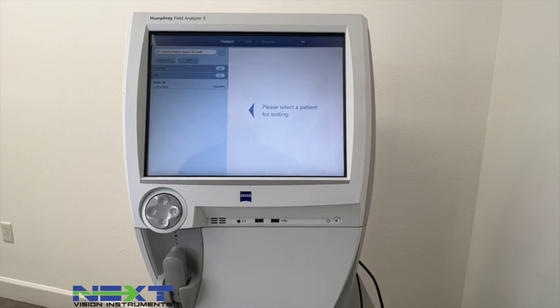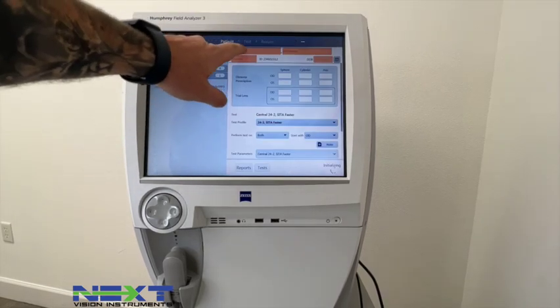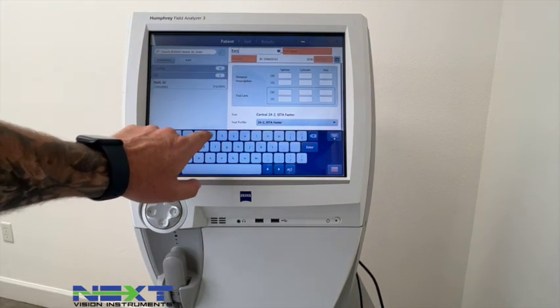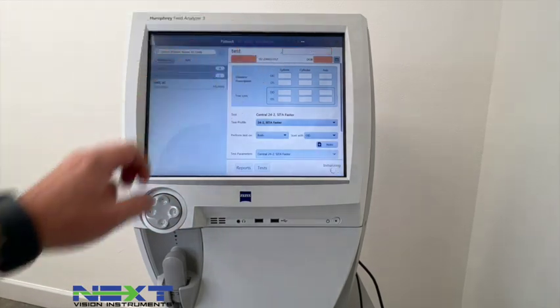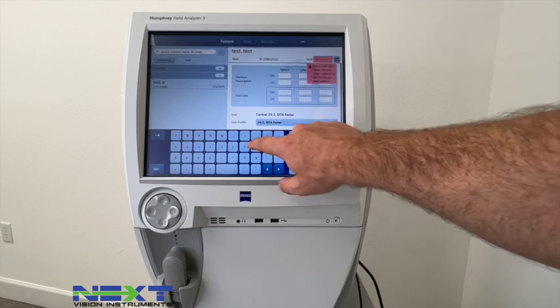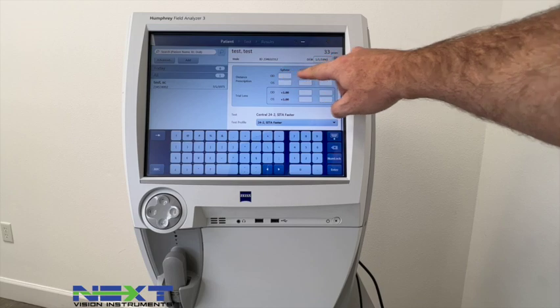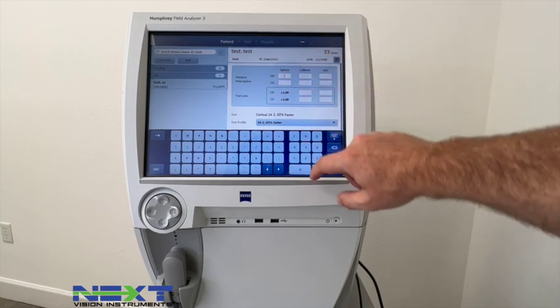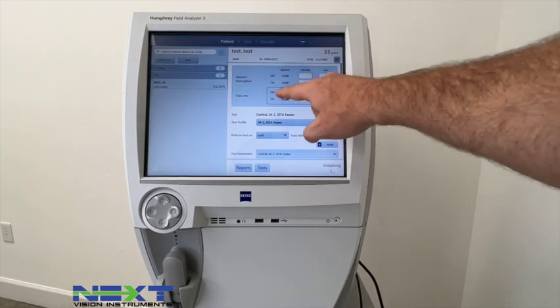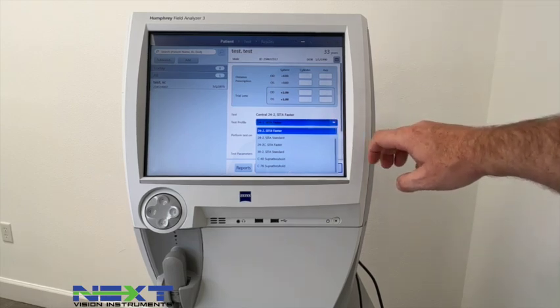This is what the home screen will look like. If you've used a Humphrey visual field in the past this should be very similar. To enter a new patient, select Add and type in their information. Enter the date of birth and it will automatically calculate the age. Their current glasses prescription goes here and it will tell you which trial lens to use.